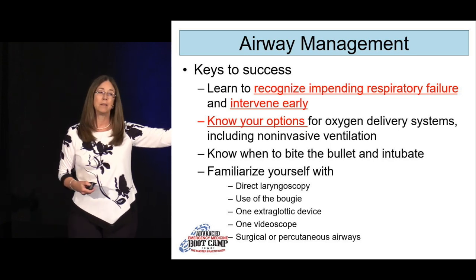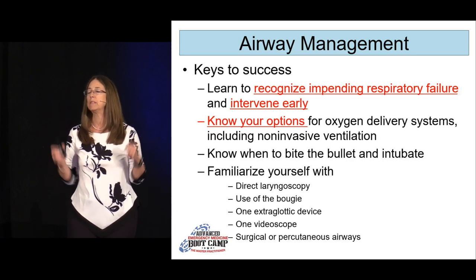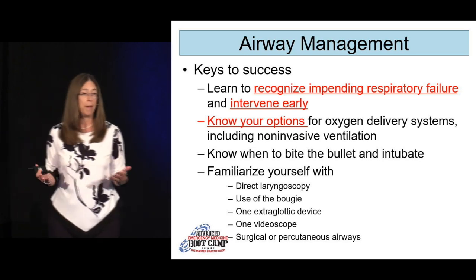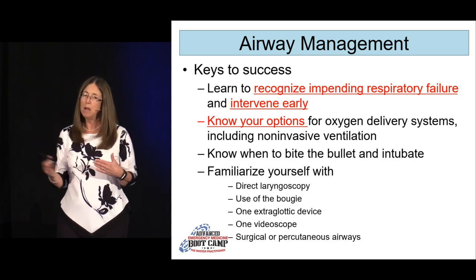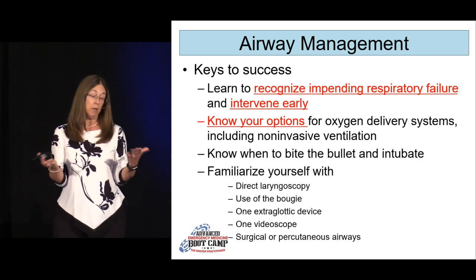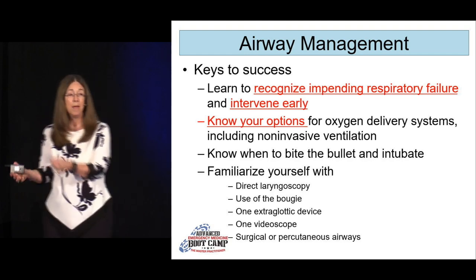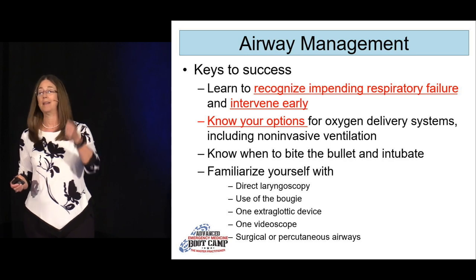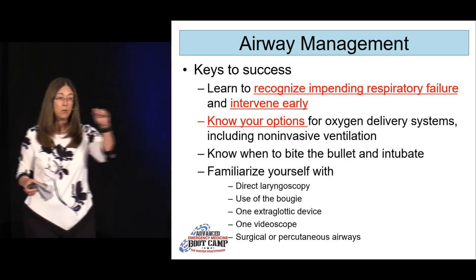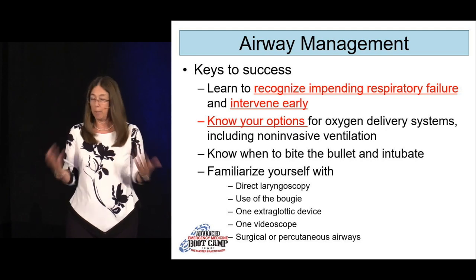What's cool about that is that if you're sophisticated in how you approach things, you're going to choose things on purpose. For example, say you have a COPDer who's working, but not terribly bad. They're on the mild to moderate range, and they're a little hypoxic. You don't want to give them too much oxygen. Well, that's the person you're going to, on purpose, grab that Venturi mask, where you can set that and say, I want an FiO2 of 27%. That way you titrate exactly how much oxygen they're getting, so you don't run the risk of driving down their hypoxic drive and having them not breathe very well.